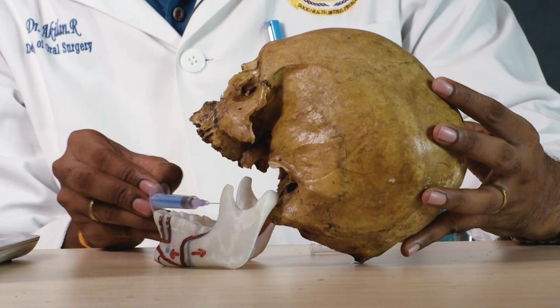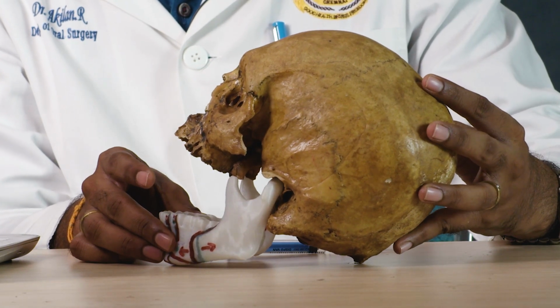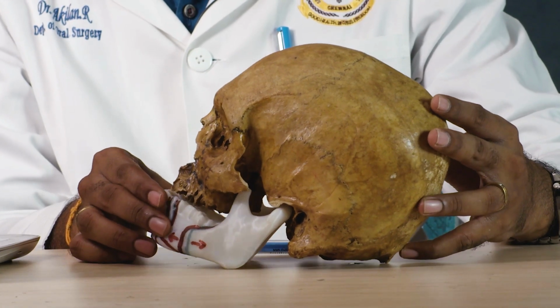Then slowly withdraw the needle, recap it safely, and ask the patient to keep the mouth wide open for few seconds in order to facilitate diffusion of local anesthetic solution.